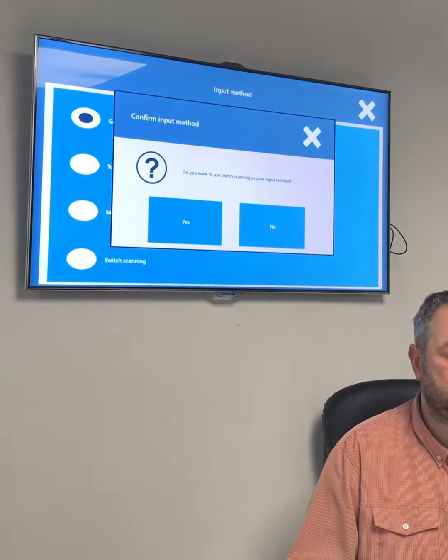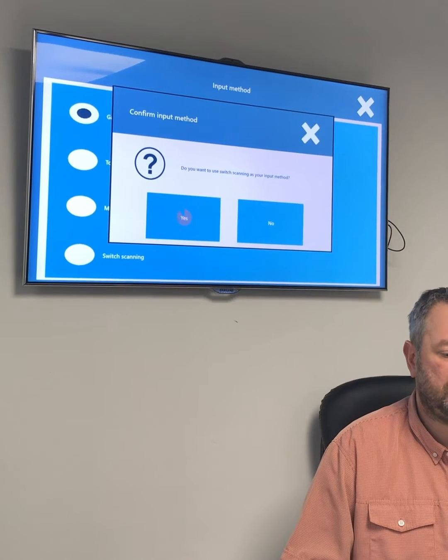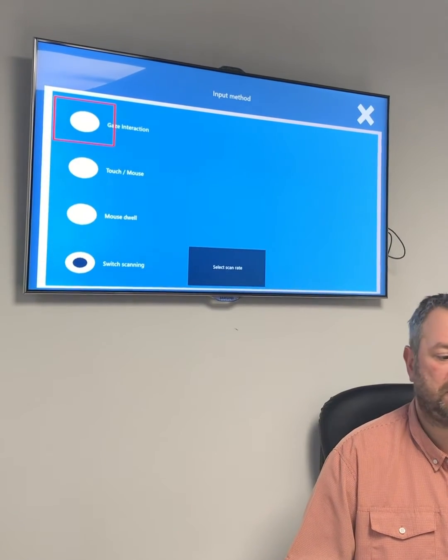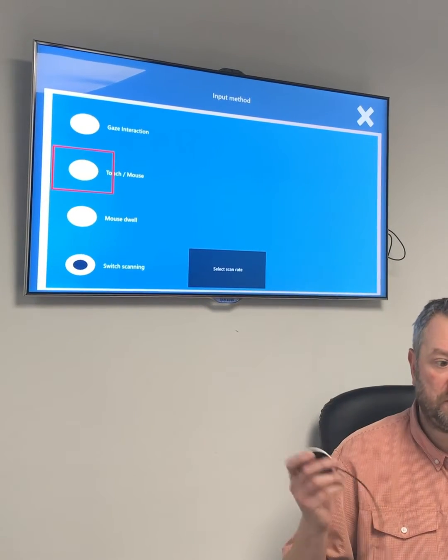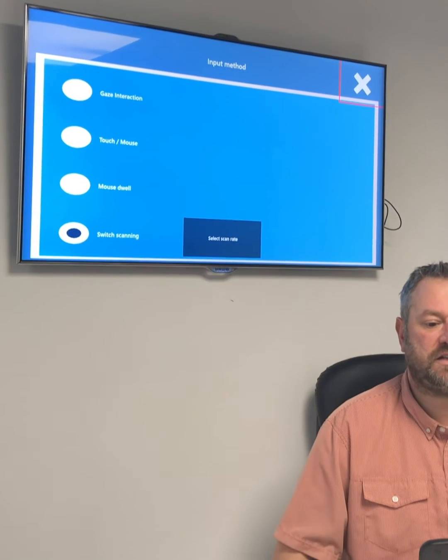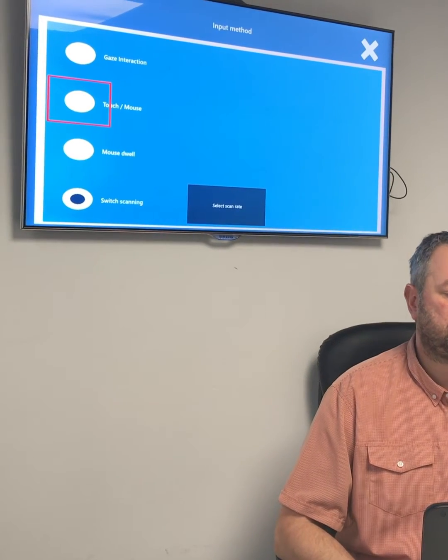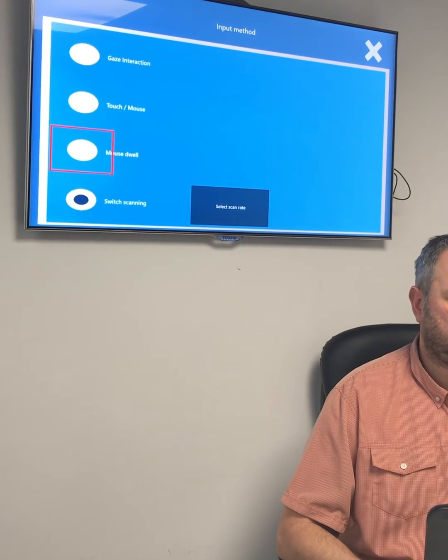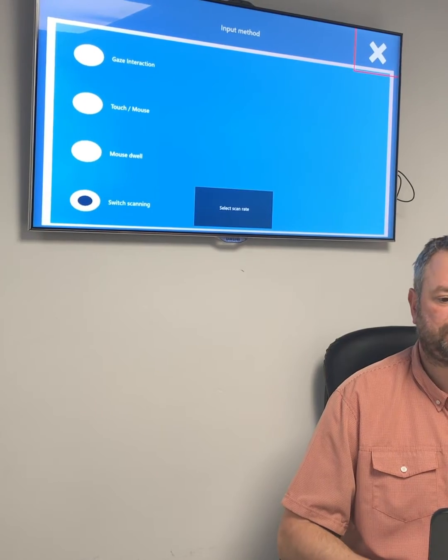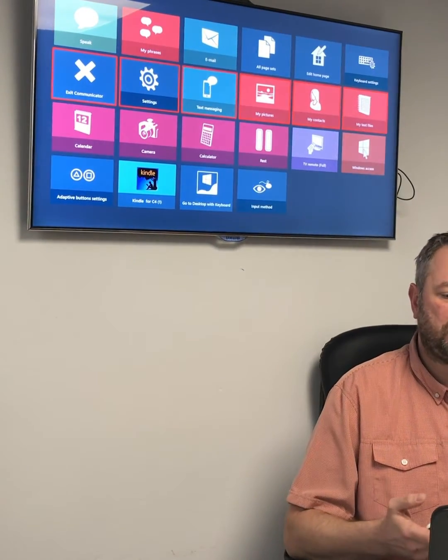When I go into switch scanning, I choose yes using eye gaze as a confirmation, and now I'm using my switch. I can exit this page and go back to the beginning using my switch. So now I'm on my homepage.